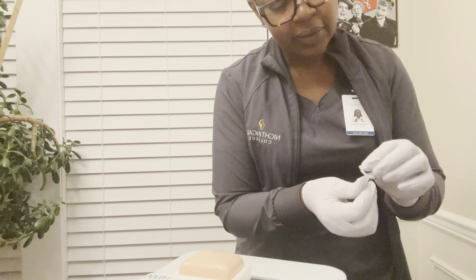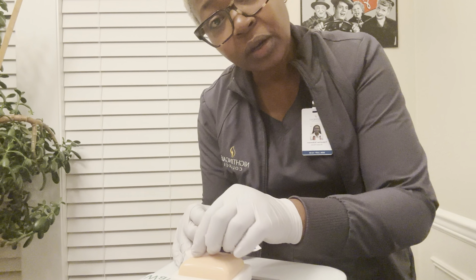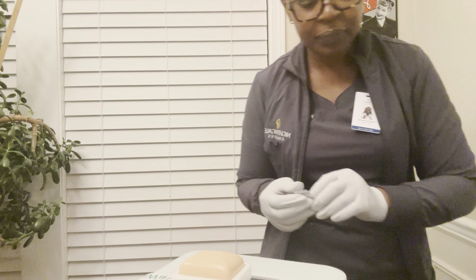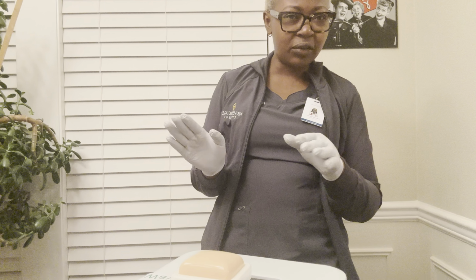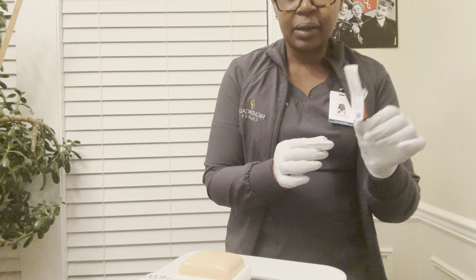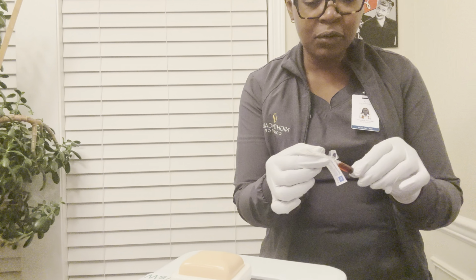So I'll go ahead and clean the area. Circular motion 2 inches away from my landmark. Flush that, and I'll wait for the site to dry up. I don't want to reintroduce that on that area. So I will then go ahead and handle my needle, and I'll remove the cap.